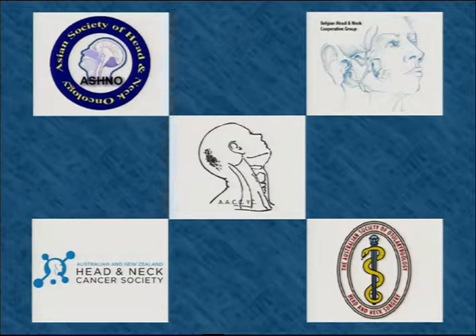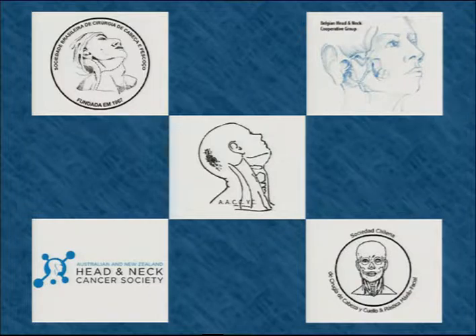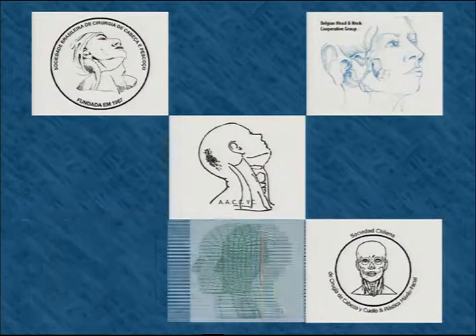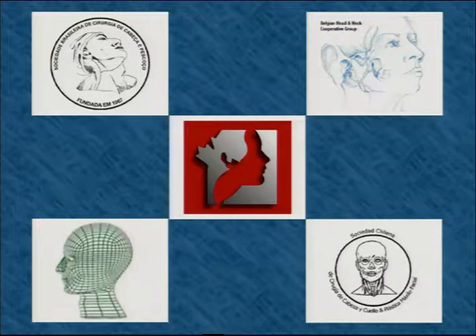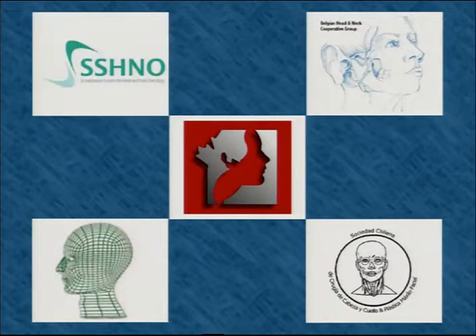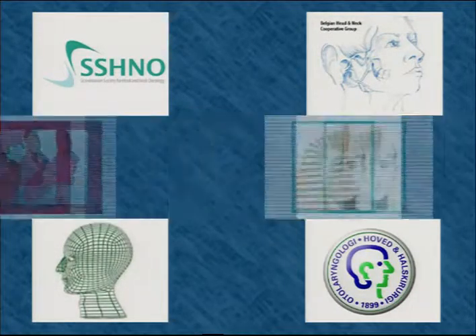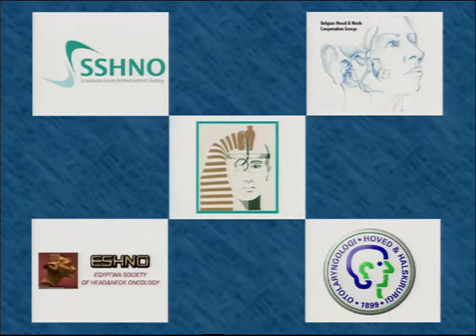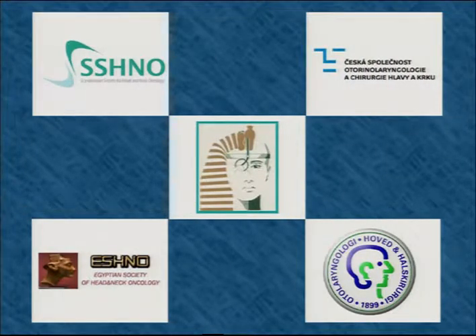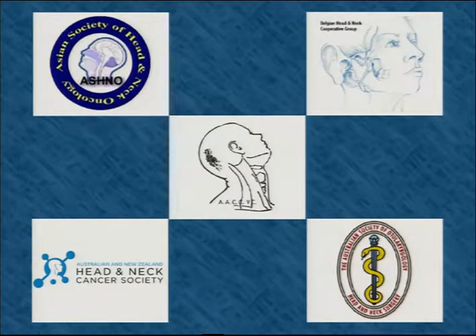So I try to take the vessels individually on the thyroid capsule itself. I use the nerve stimulator to map out where that nerve is coming into the larynx, and whether it is away from those vessels or not. And I dissect very carefully in that prelaryngeal space between the vessels and the larynx, trying to look for that nerve as it hooks around in that upper part of that triangle. So those are some of the things that I do to try to safely preserve that branch.